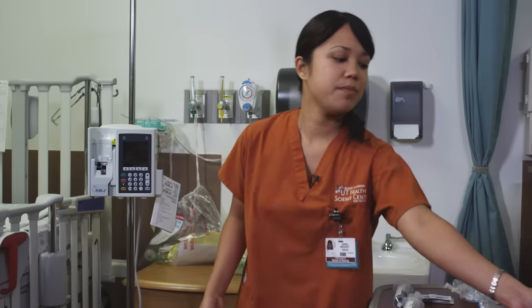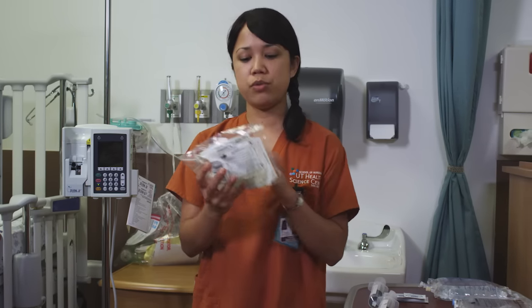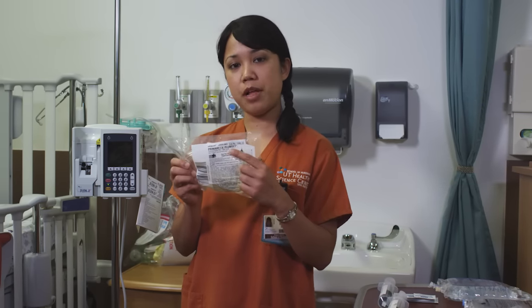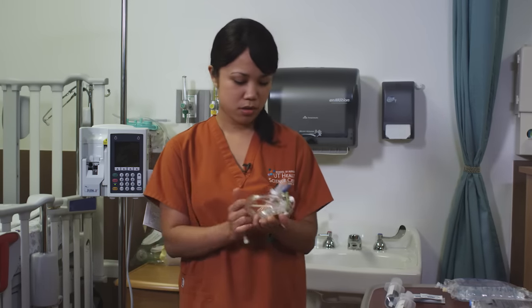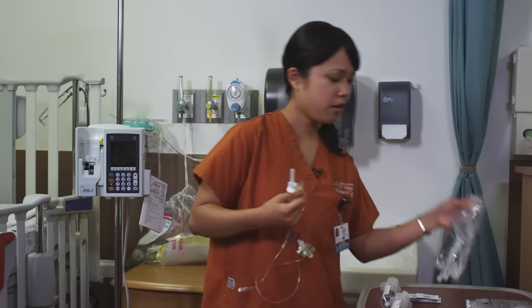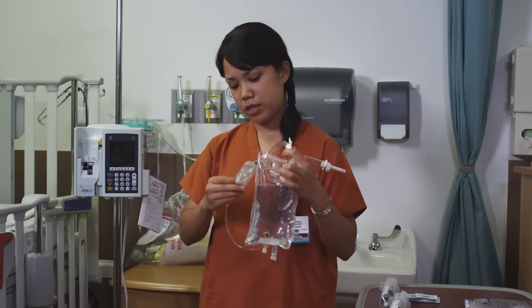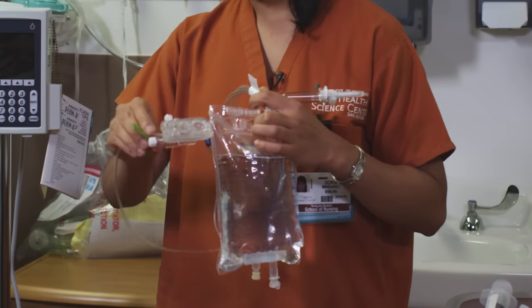First we would prime your IV bag with this tubing, which would be your primary IV plum set. It's specific to the plum pump. So you take this out. You have your bag here. First you want to make sure that your tubing is clamped, so your fluid doesn't flow down the tubing.